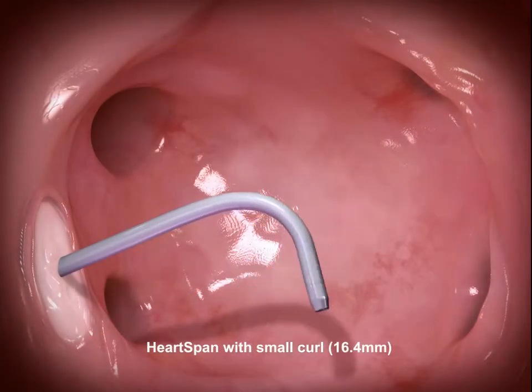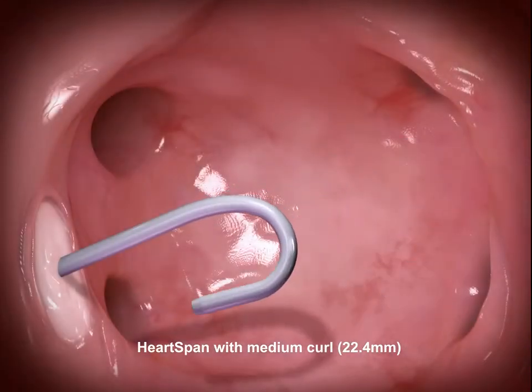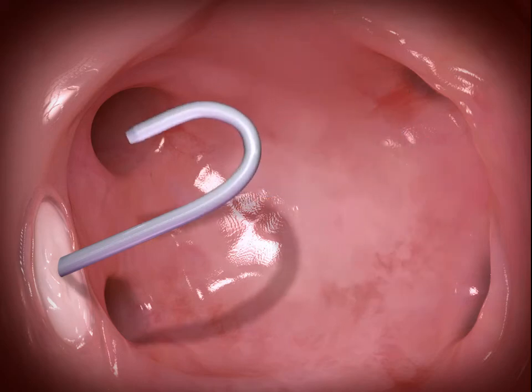A low crossing profile from dilator to introducer creates a smooth transition to reduce trauma to the atrial septum. The introducer handle has bi-directional 180 degree deflection and three curl sizes for navigating anatomical variations.